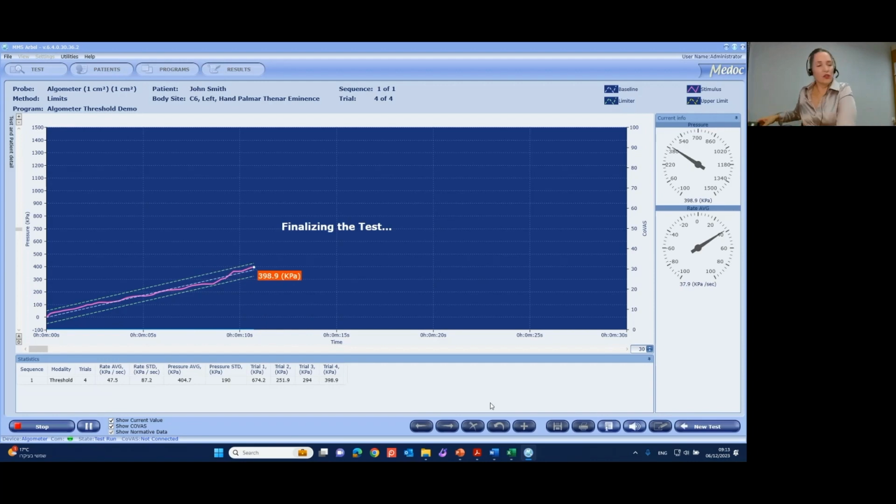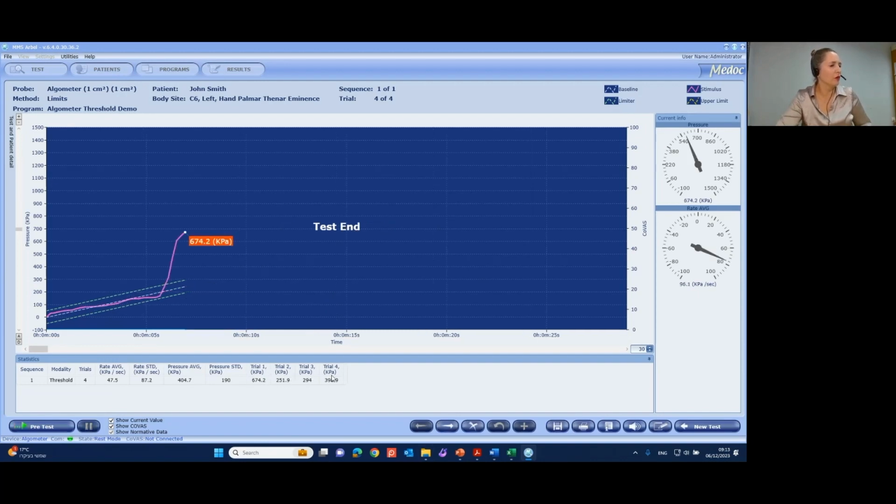So this is after I did 4 different stimulations. And you can see below trial 1, trial 2, trial 3, trial 4. And you can see me messing around during trial 1. And you can also look visually at what the pressure looked like when I exerted it. Let's stop this share and go back to the presentation.